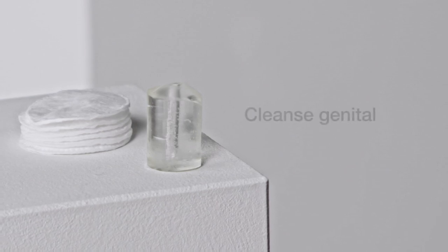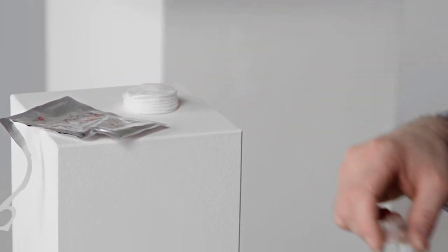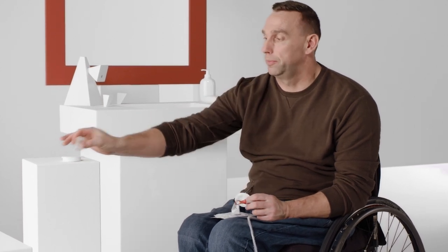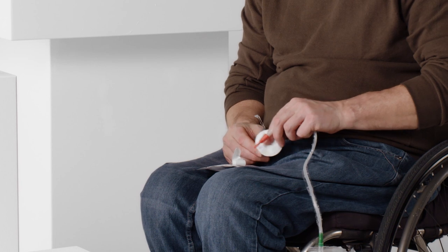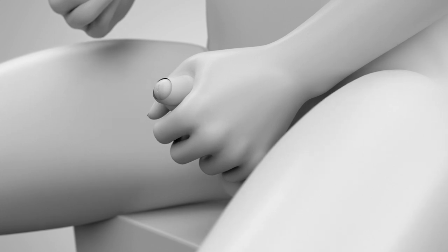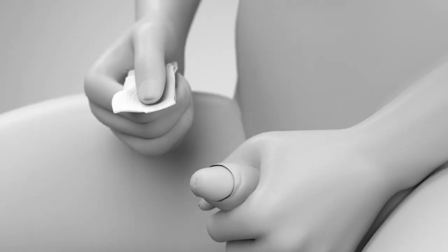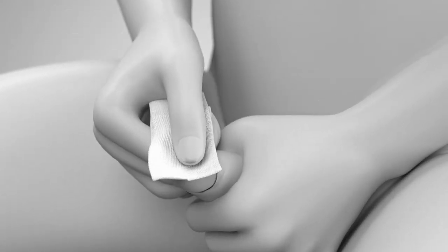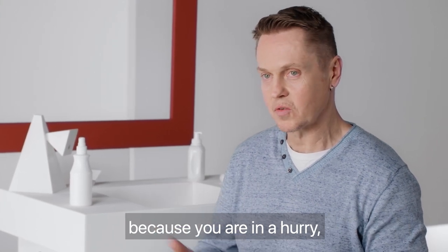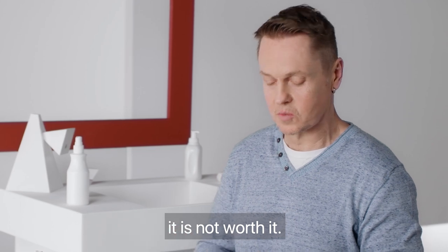Now it is time to cleanse the glans of your penis. Before I take the tip off, I'll take a wipe and clean the top of my penis. Hold the penis with your non-dominant hand and don't let go until you have finished the procedure. Pull back foreskin if present and cleanse the glans as trained by your healthcare professional. There's nothing worse than working with an unclean area — you can end up with an infection for 2–3 weeks.